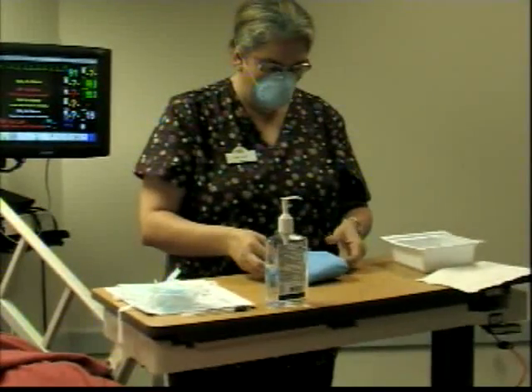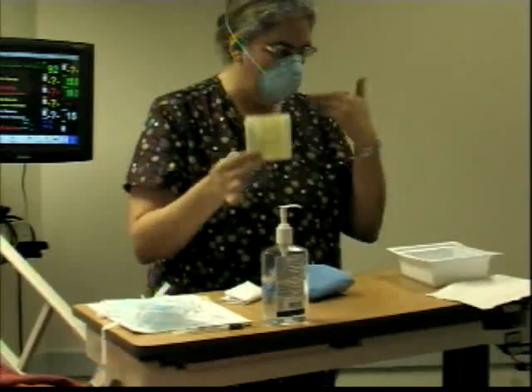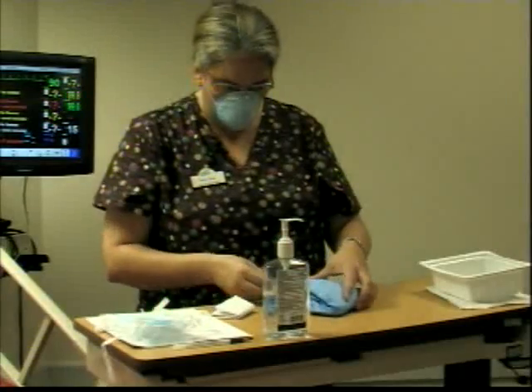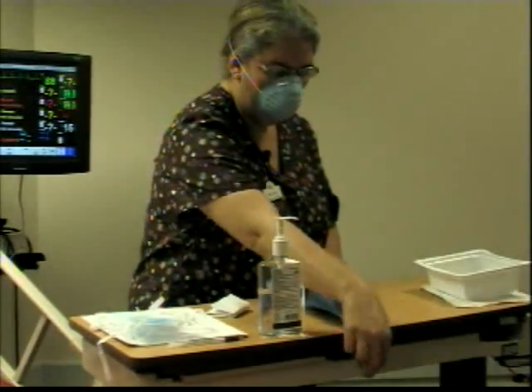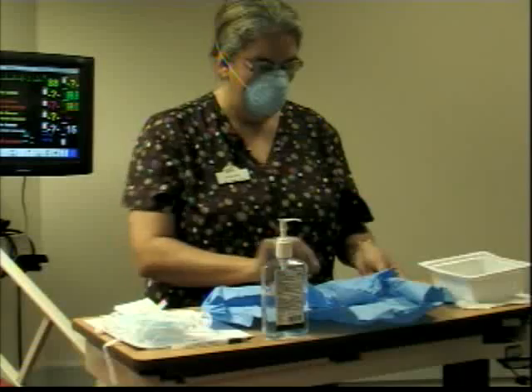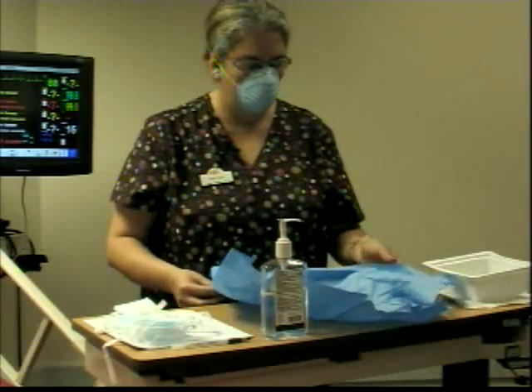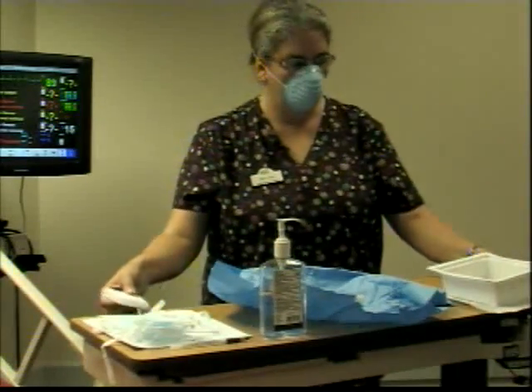This kit in here already has the gloves in here, and it has another mask, but I already have put a mask on to take the other dressing off, so I'm just going to put it on the side. And I'm going to open the packets the way we were taught, away from you, side to side, and towards you. And you have everything that you need in there. And remember about the borders.